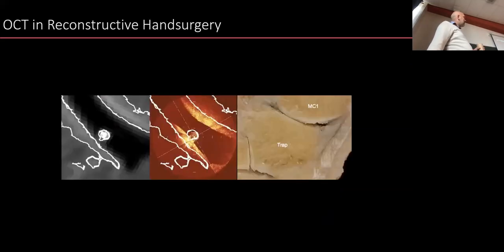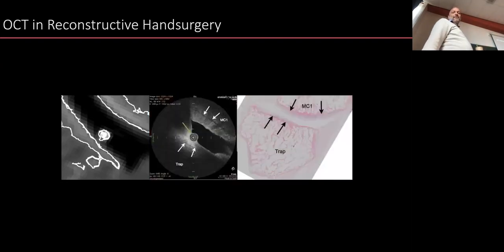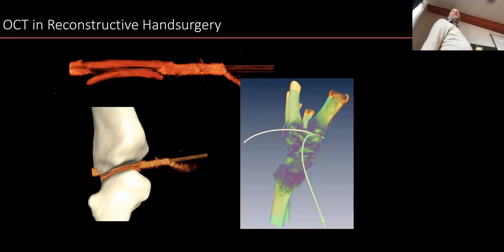Of course we do this in 3D, but here you can see how it fits together on the CT scan. This is a 4-second CT scan. We segment out the edge of the bone there, and we were able to fit the OCT data set exactly on the CT scan. Histology again confirmed it. So it's much nicer to do this in humans than in goats. Goats, yeah. And it gives us this beautiful tool that tells us the state of cartilage.